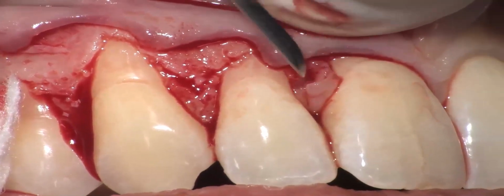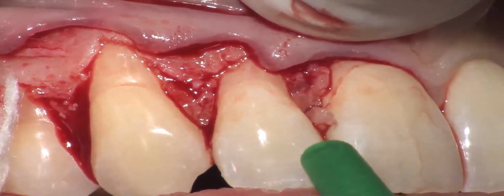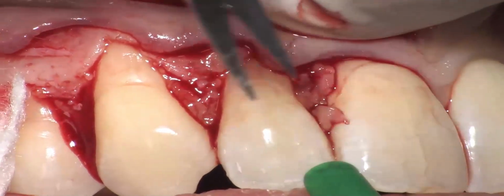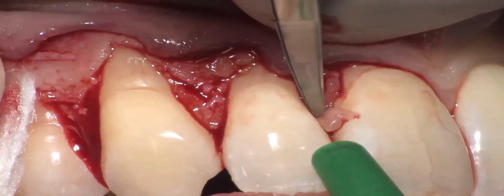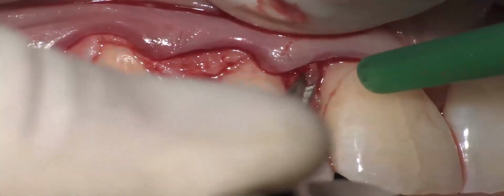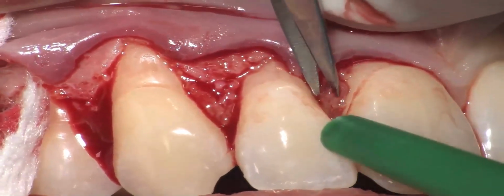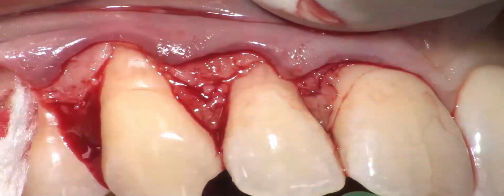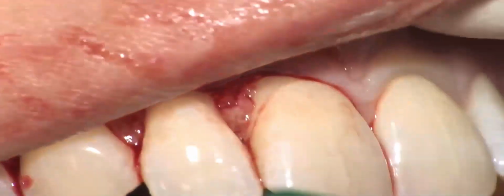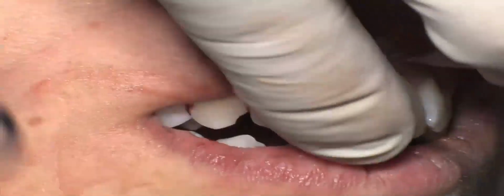make it separated from the connective tissue, and this surface is followed by the microsurgical scissors so that all epithelium remnants are eliminated. Now we can see the whole area of the surgery.